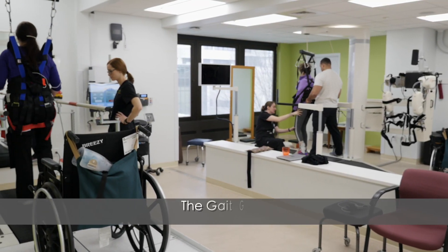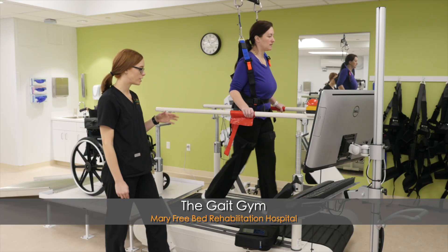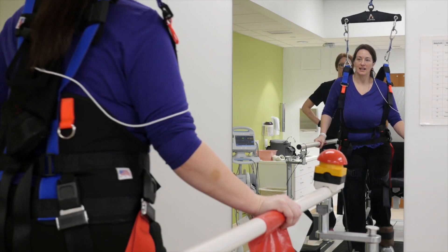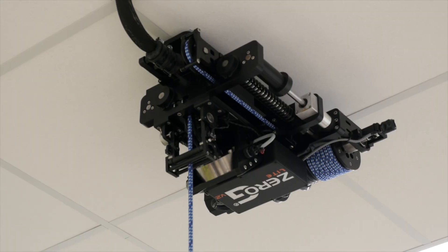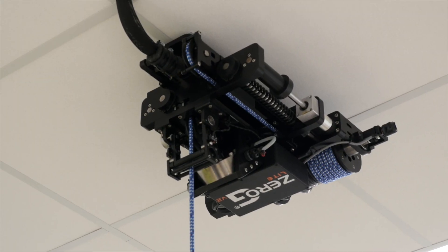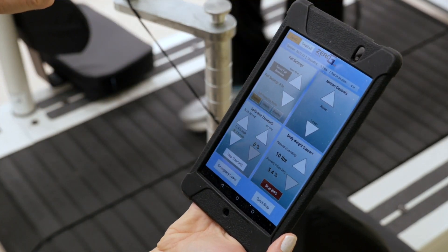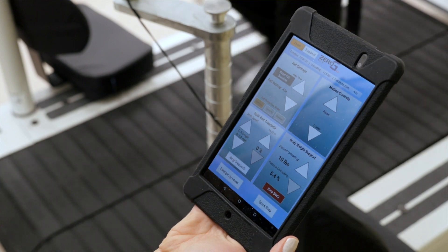We're in the gait gym, where a lot of treadmill training and walking happens. We're using the Zero G body weight support system with the treadmill right now. It can take off a little bit of body weight so it's easier for Nikki to work, and it also provides fall protection — Nikki's not going to fall in this harness. There's a setting where if she moves more than four inches, the treadmill stops, so it's a nice confidence thing too.